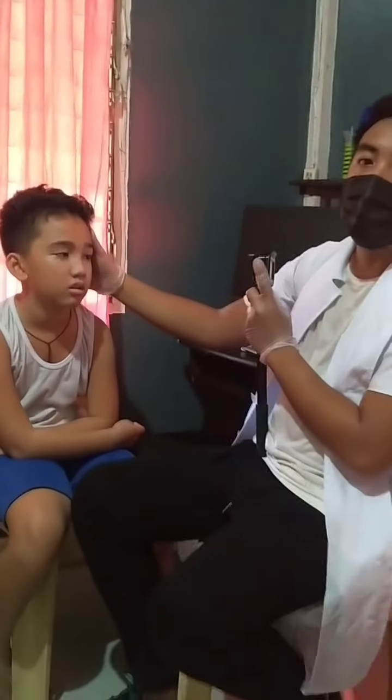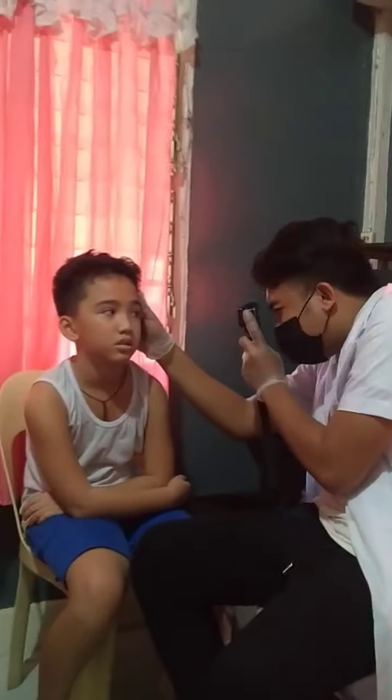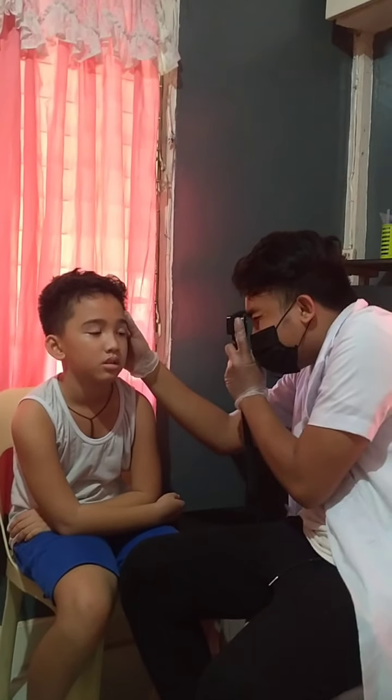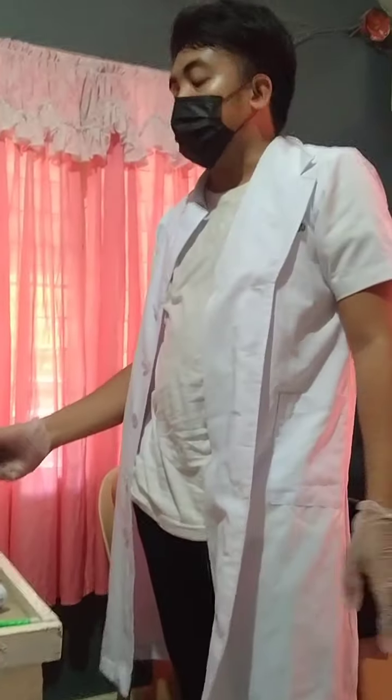And this is to check for red reflex on the patient's pupils. Then turn on the light. Then do it on the other side as well. So red reflex is positive on the pupil area of the patient.